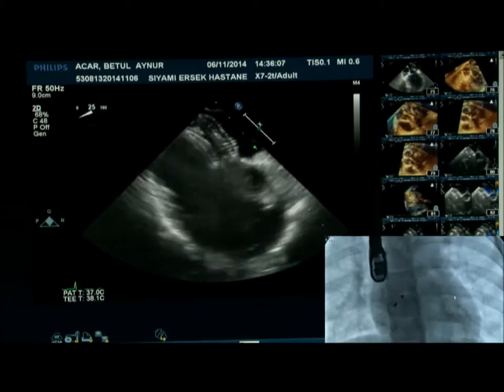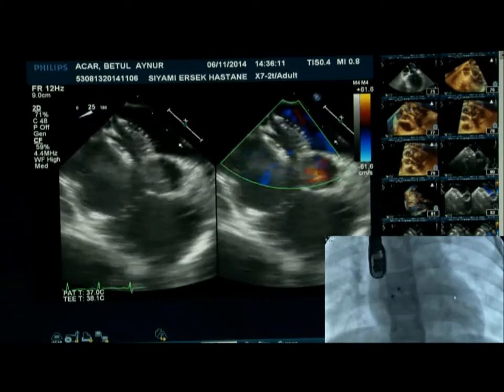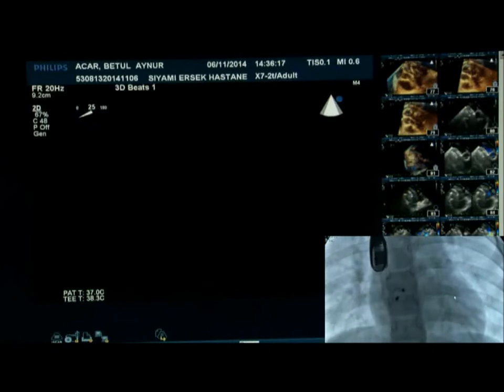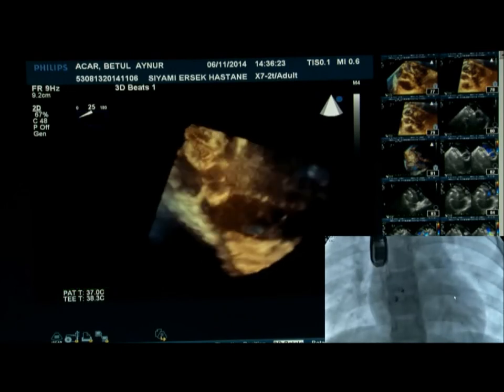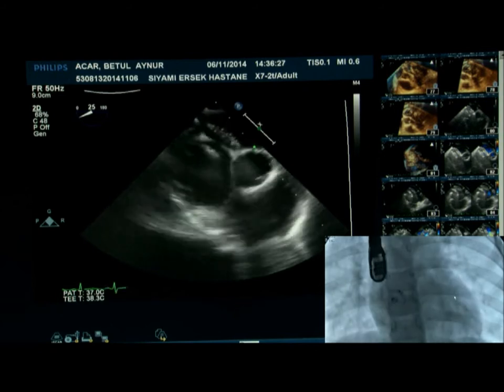We have chance to go there. It's a good patient for the manipulation. We have aortic rim, no problem. We can put smaller device and check it. If we are happy, we can release. For me, I was trying first. This is not 18. It's not a good choice, but they have already opened the device.